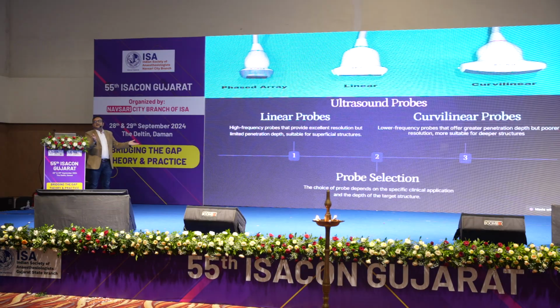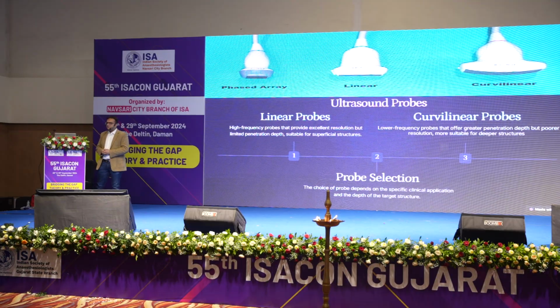Now, as the machine has started, it is time to select the probe. Which probe do we have to select? We have to go back to the physics again. Now, what happens when the sound wave is generated? The sound wave hits the object or subject and then it comes back. When it comes back, only then is the sound wave going to be registered.